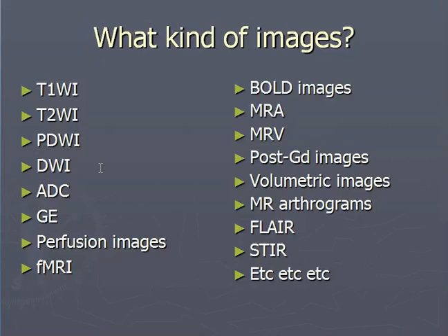Volumetric images, MR arthrogram, FLAIR images, STIR, and etc. We have a long list of other images which can be deployed to see the tissue differences.